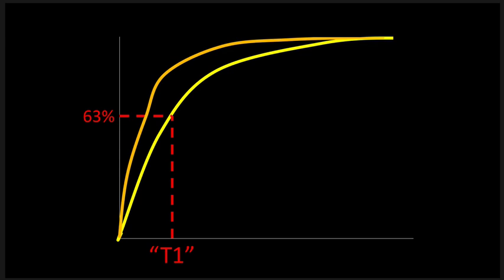So, like large stationary things have low vibrations, and therefore they are very efficient at giving their energy back. Whereas something like water has a high vibration, and therefore it is terrible at giving back its energy. And we're going to talk about why in a second. But I want to drive home this idea of movement and heat being the same thing.